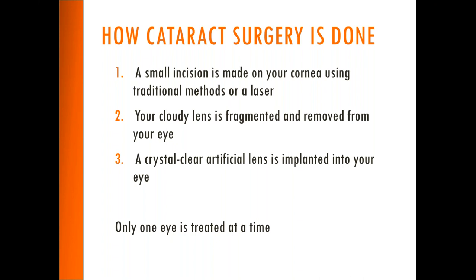The initial part of our surgery is where we insert a speculum that will keep your eyes open. So you won't be dependent on keeping your eyes open throughout the entire procedure. The very first step is then making small incisions that allow me access to inside the eye to remove that cataract. Once we make the incisions, we perform a part of the procedure called the capsulotomy, which is a round incision around the natural covering of your eye called the capsule.